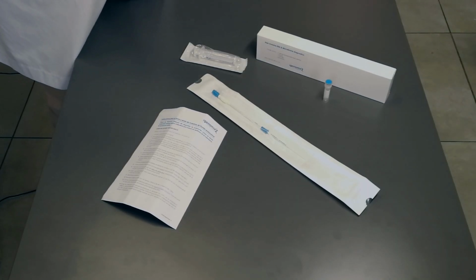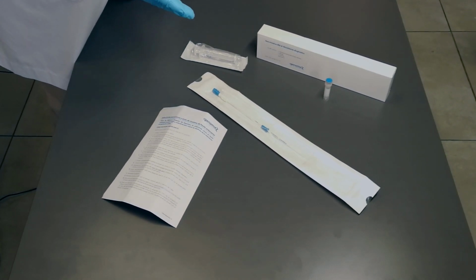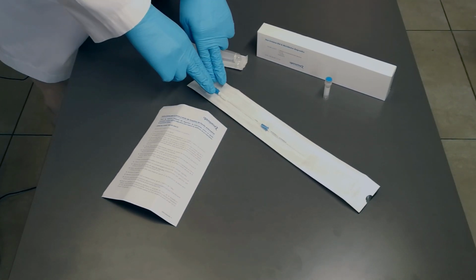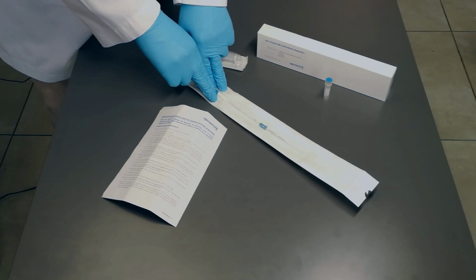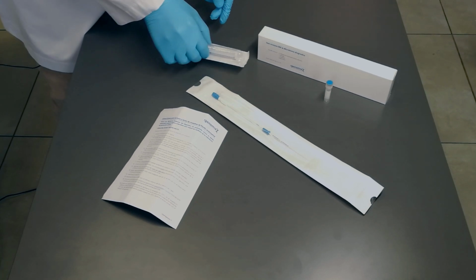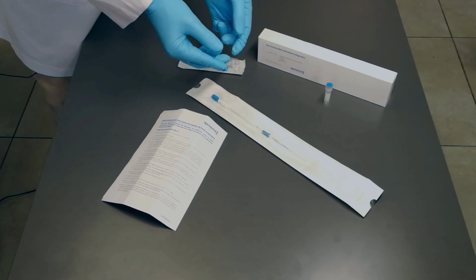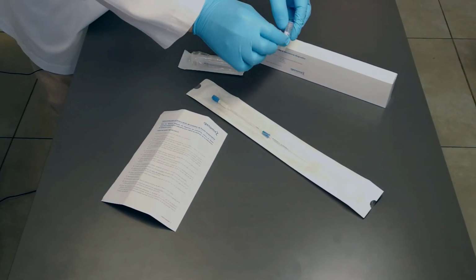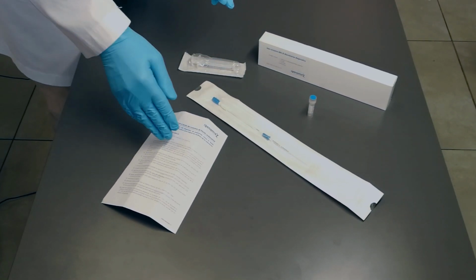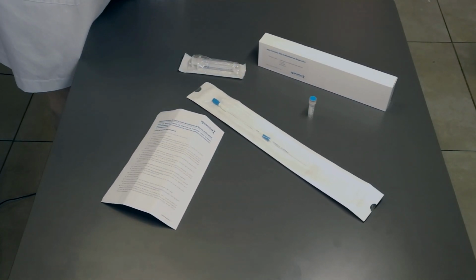The required material to perform the extraction of endometrial fluid will be provided to the clinician and is as follows. We need a speculum to visualize the cervix, a transfer catheter that will be inserted into the cervix, a 10 ml syringe that we will connect to the transfer catheter that will aim to do the proper vacuum to extract the endometrial fluid, and once the fluid is obtained, it must be introduced into the provided cryotube. The instructions will also be included. All this material will be provided to the gynecologist in this kit.